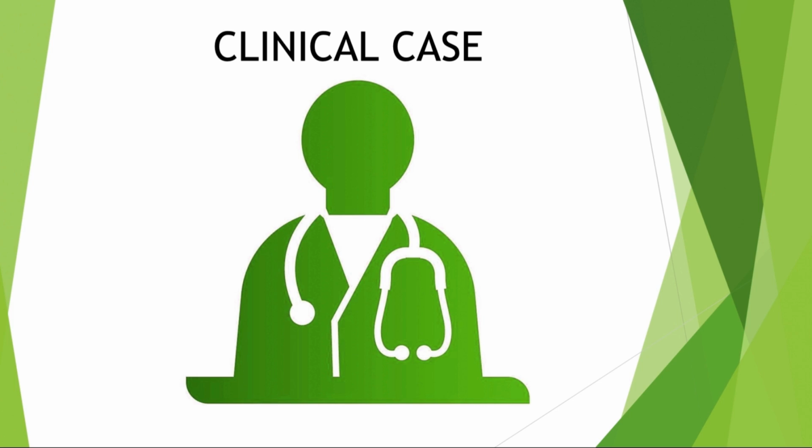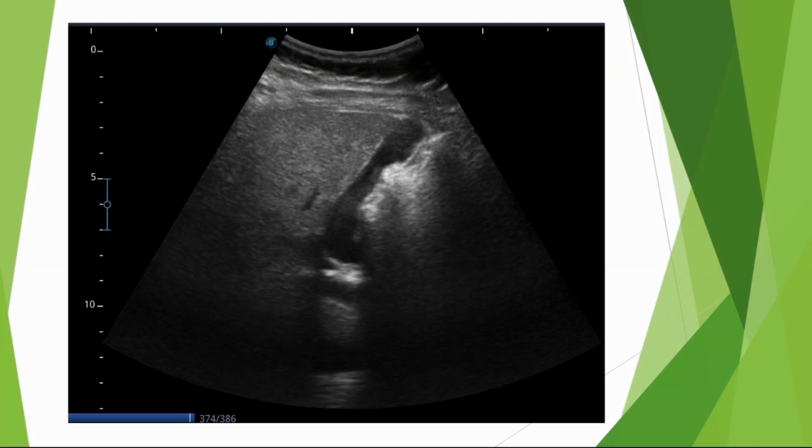So, of course, right away, pain triggered by meals and pain in the right upper quadrant, we're going to think about the gallbladder. Since the ultrasound machine is right next to our exam table, it's very quick to just grab the probe. And here are the images we get.